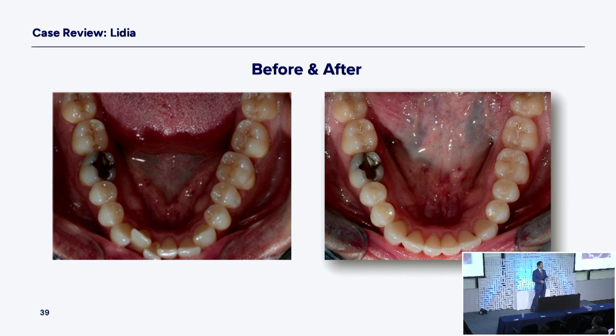Every now and then you get a patient who's got all 32. But if you have 32 and your front teeth are crowded, how many teeth do you have to move? All of them. They were all moving in the middle. In the video, when we played the video, every tooth moved a little bit. Every tooth moved a little bit. So with every tooth moving a little bit, we get to this point.